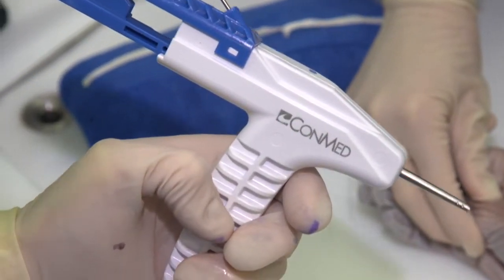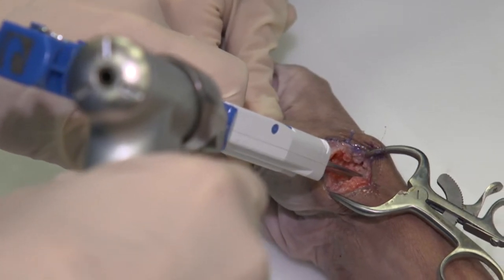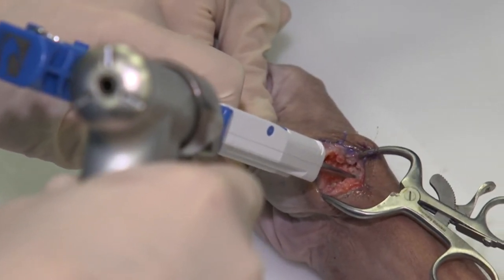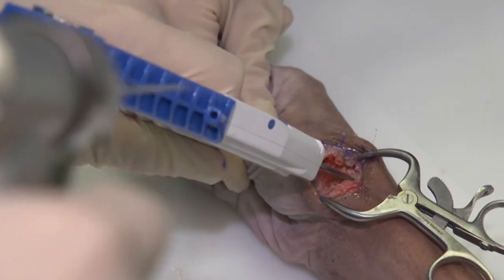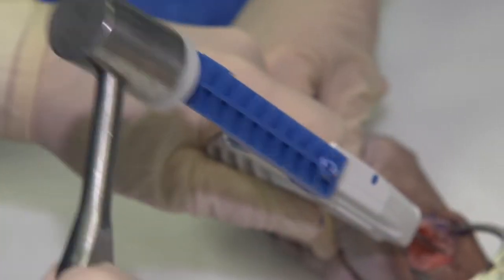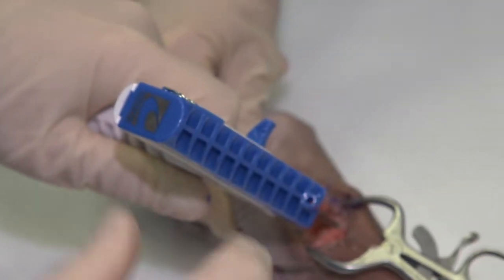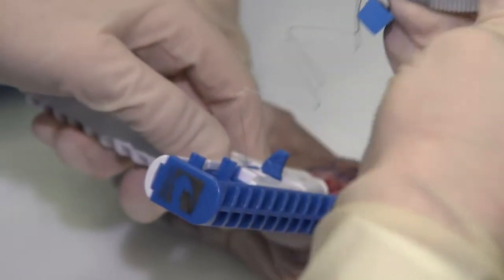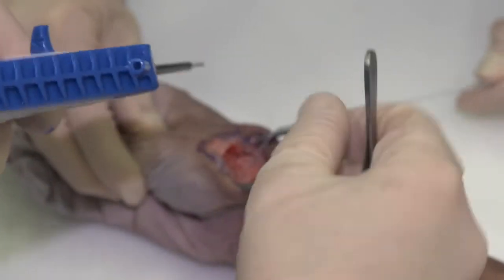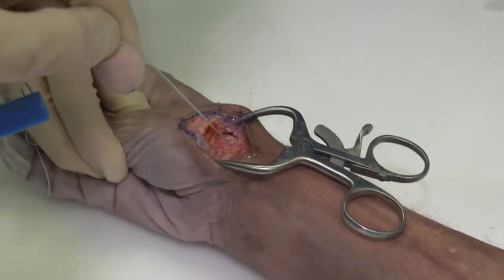The TrueShot with Y-Notch Yellow will now be placed into the trapezoid. Hold it against bone firmly, drill the guide wire until it reaches its endpoint, and pull the drill out. Then mallet the deployment guide until it is completely engaged. The latch is brought down with your thumb to deploy. Remove the sutures and pull everything back — excellent deployment of the anchor.